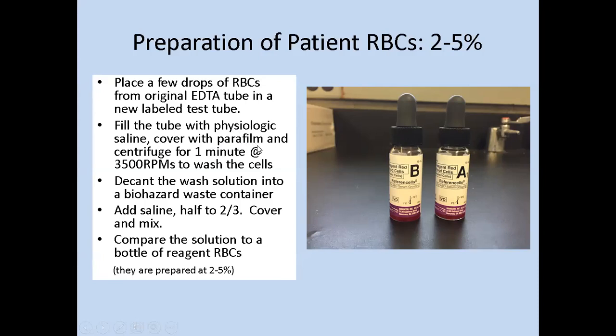It's not going to have a lot of pink or red color to it, and that's good enough. But washing, just remember the purpose always is just to remove unbound proteins and complement that might be in the tube. So we're going to decant that wash solution into a biohazard container, get rid of it. We just tilt the tube without hesitating and pour it off, so to speak. And the red cells, we're still going to have some red cells in the bottom of that tube.